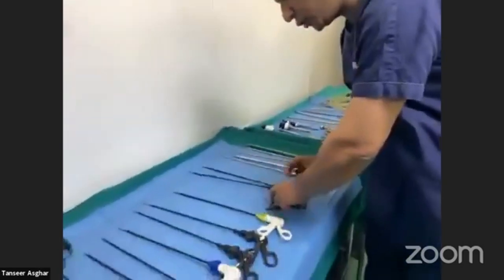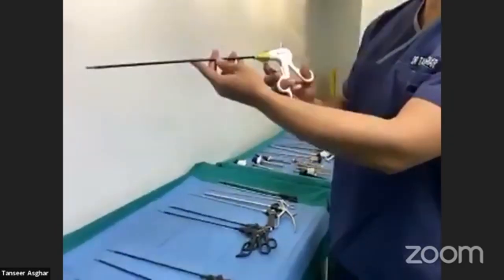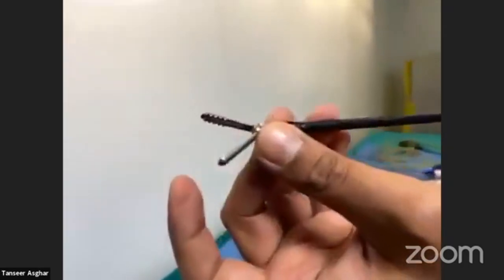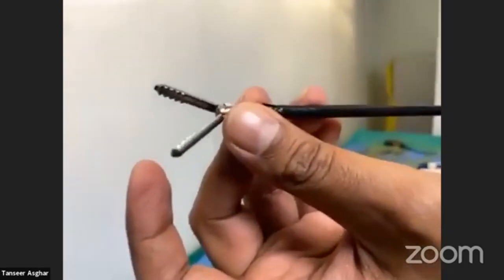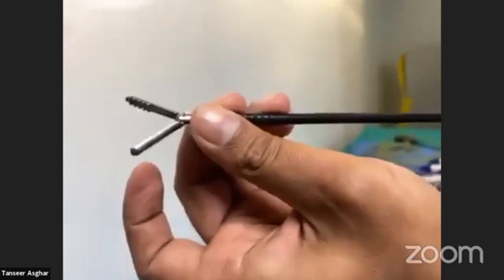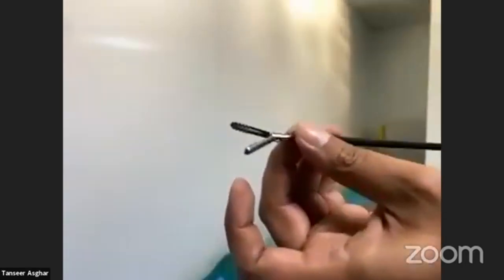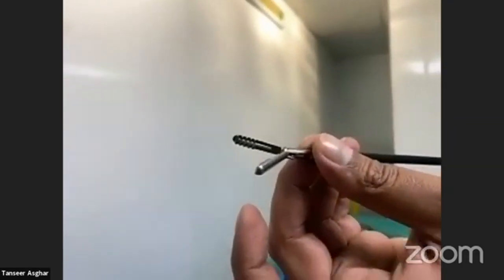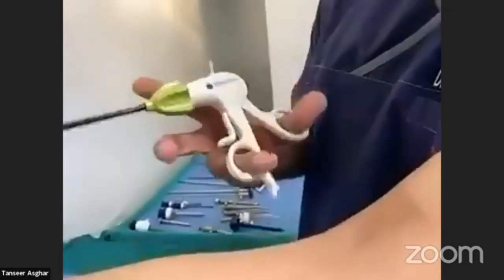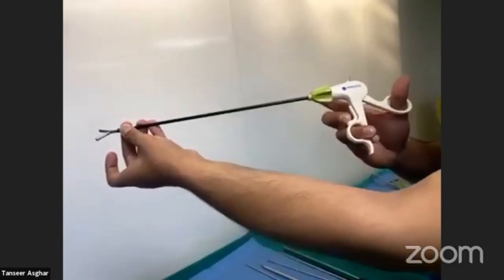Now I will show you a disposable grasper with a lock. Here you can see the lock. It is a grasper with ridges that holds the viscera well — for example, in laparoscopic cholecystectomy with an inflamed or empyematous gallbladder. When locked, it cannot be opened until you unlock it.